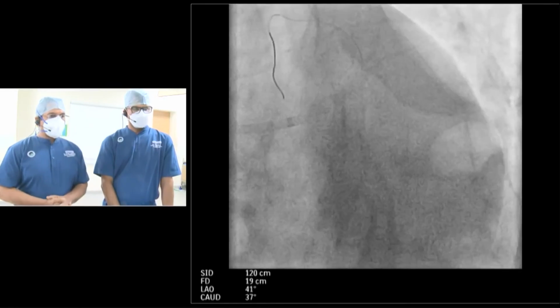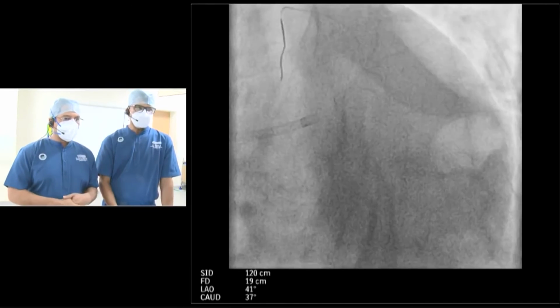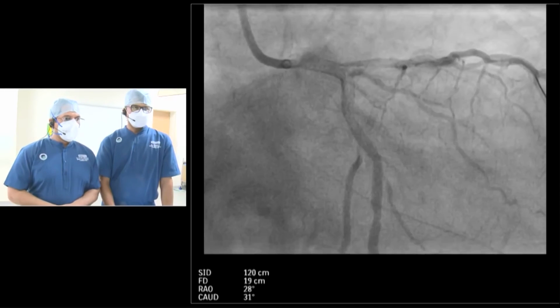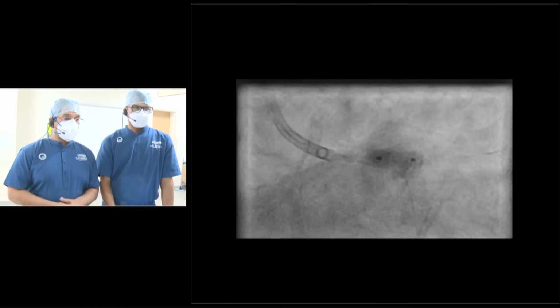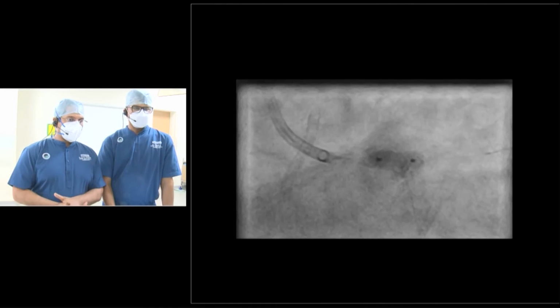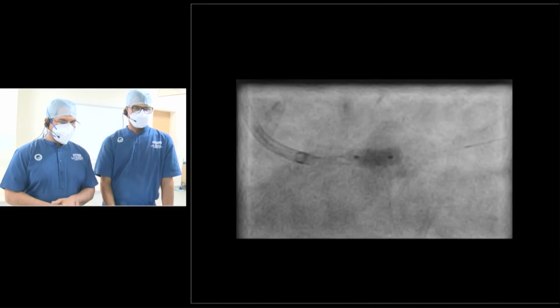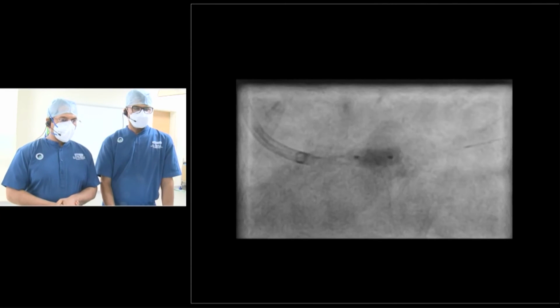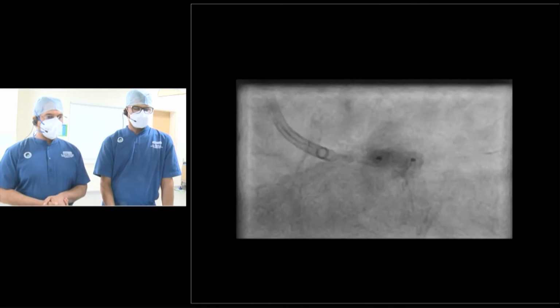So after stenting the left main to LAD, the blood flow is still good and the carina is looking good. We recrossed and first did the post dilatation of the LAD stent with a 3.5 by 8 millimeter balloon. We went up to 20 atmospheres, so the entire length was dilated.